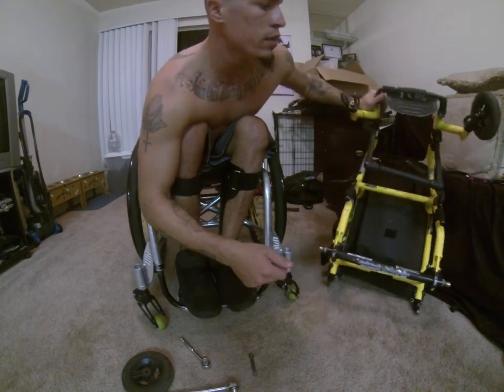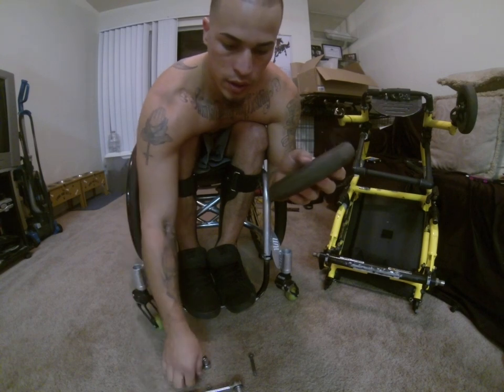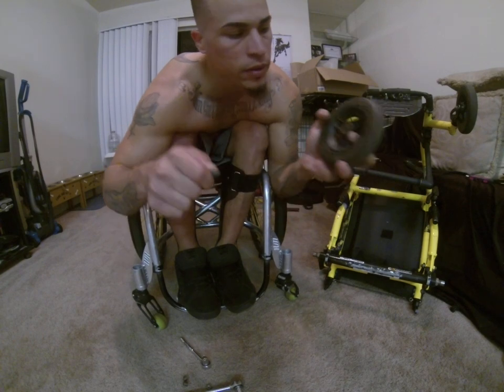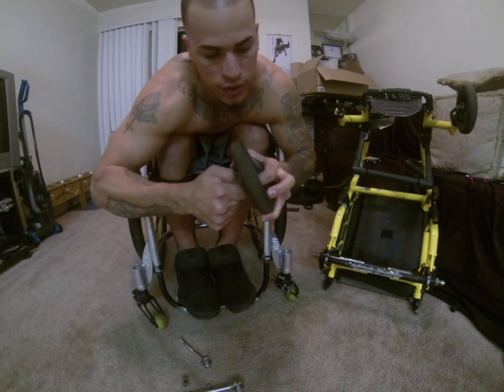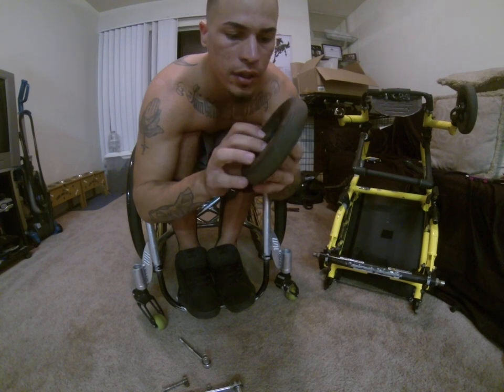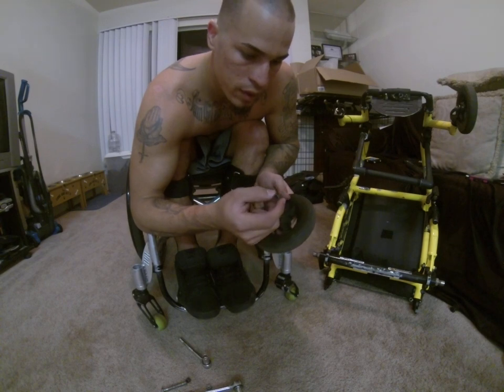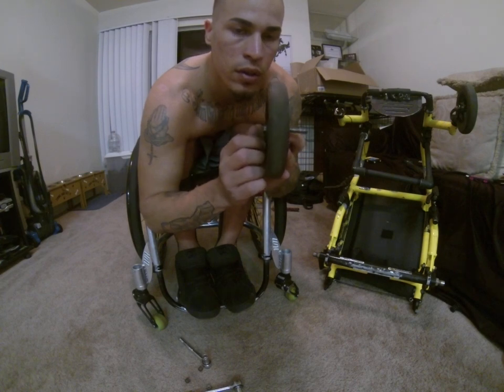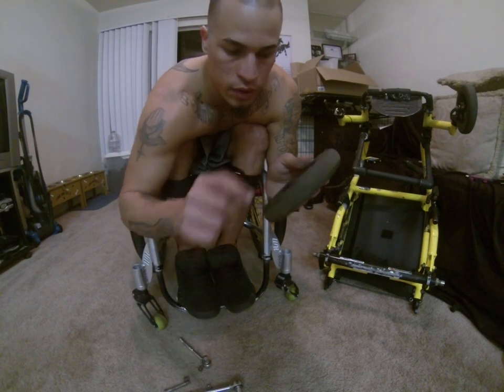Alright? Then, inside the wheel, in the hub, you pop this out. You can use a screwdriver. Sometimes they're stuck in there. I think I'm going to have to use a screwdriver. Pop it out, because they rust and it ends up getting stuck in there. Alright, so I'm going to pop that out in a few seconds. But inside, there's actually another one of these. And that goes in the middle, in between, for the axle to go right through. Keeps it nice and smooth so it can spin fast. So you want to make sure you have all three of those.